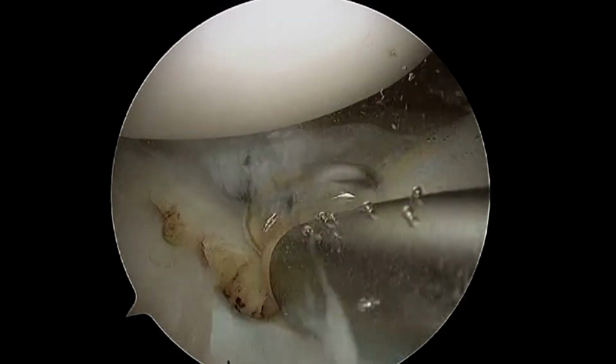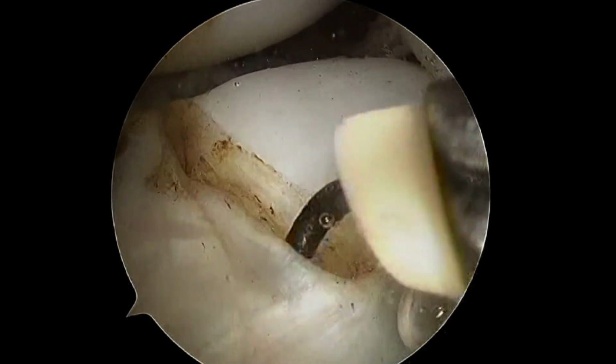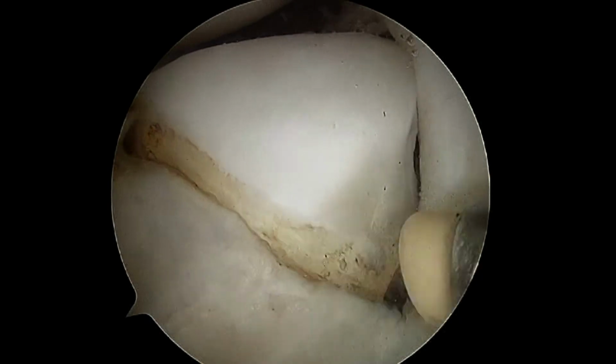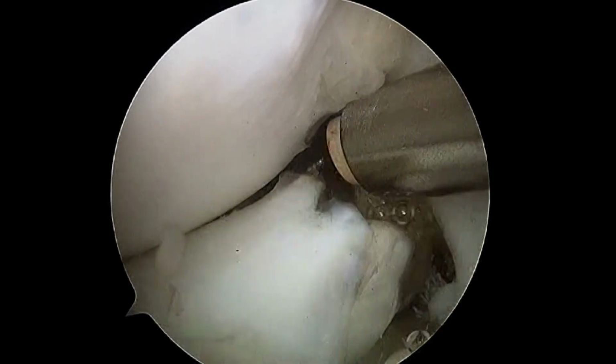Here a radiofrequency probe is used to mark and make the anterior cut. The probe is then used to carry out the posterior cut, including the tear in the process. The central portion is cut with punches and removed with a shaver.